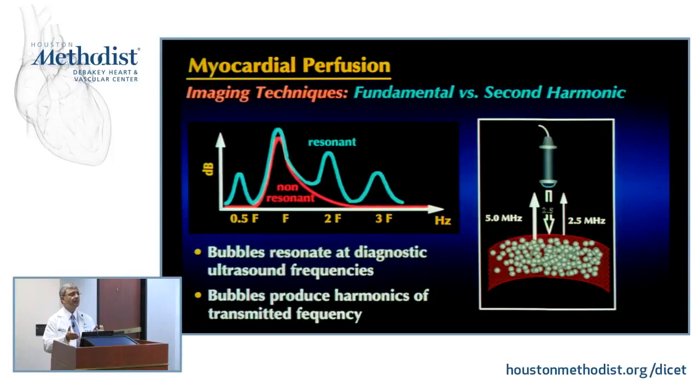This is actually where the research started in trying to figure out how you optimize contrast imaging. One byproduct of that was what? Your regular harmonic imaging. We found out, we never thought that the myocardium per se would emit second harmonics. Okay?